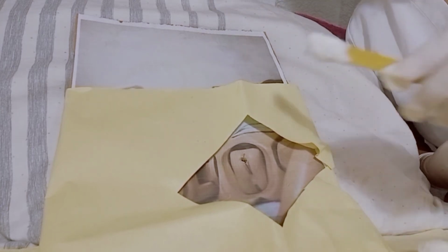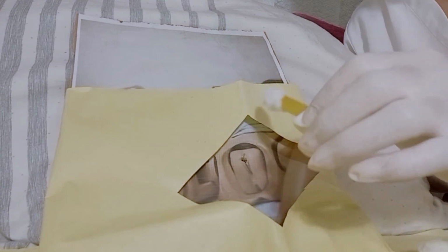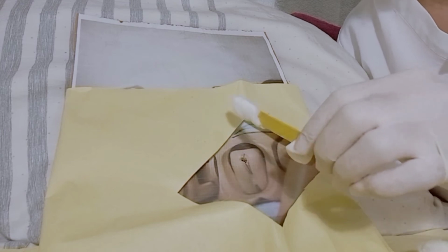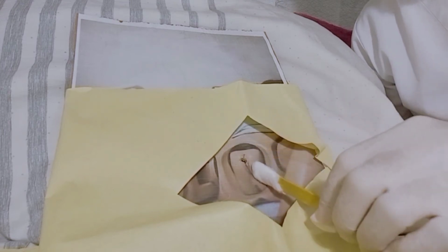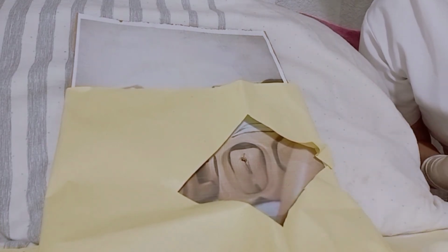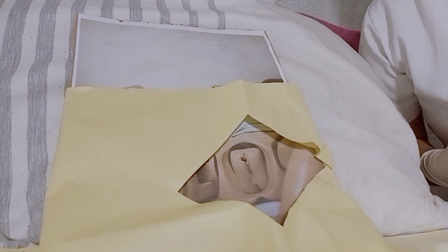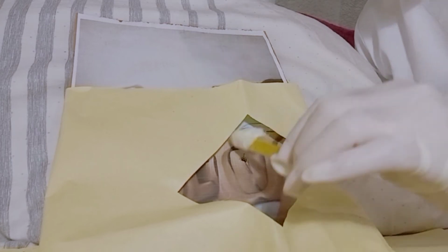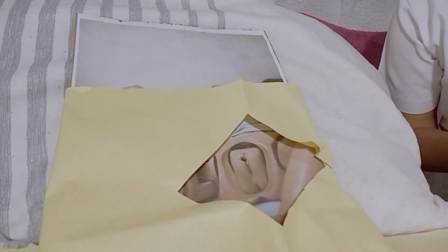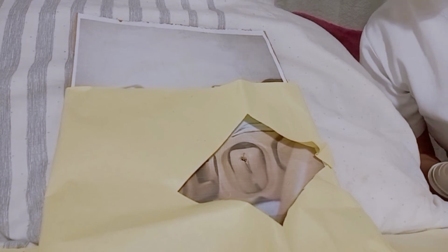Making one downward stroke with each cotton ball, begin with the labium on the side farther from you and move toward the labium closer to you. Cleanse the meatus without cross-contaminating or contaminating the sterile field. Afterward, wipe once down the center of the meatus, wiping with each cotton ball and discarding it.